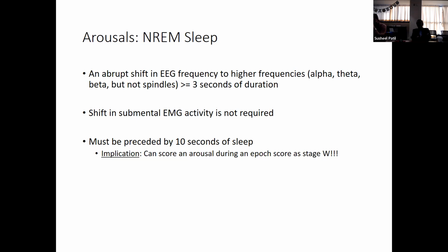So the only part we didn't have time to round out from the standpoint of sleep assessment is just looking at arousal. If you remember from last time, we talked about sleep staging. But the last part of this that I wanted to round out was arousals, before moving on to some of the other signals that we have.